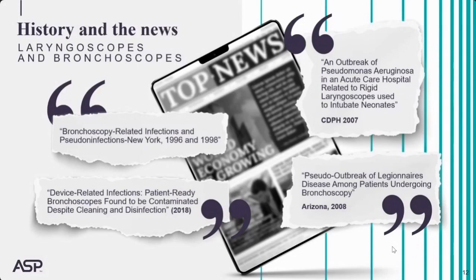Five babies were affected. The event shut down the hospital's neonatal ICU, and unfortunately, a few of the babies lost their lives. This event and others changed the recommendation for reprocessing laryngoscope blades and handles by the California Department of Health and then eventually throughout many other states in the country. Yes, some of these events were a long time ago, but are significant and relevant to our practice today. We're going to take a closer look at a study that was done in 2018, a little later in the presentation.